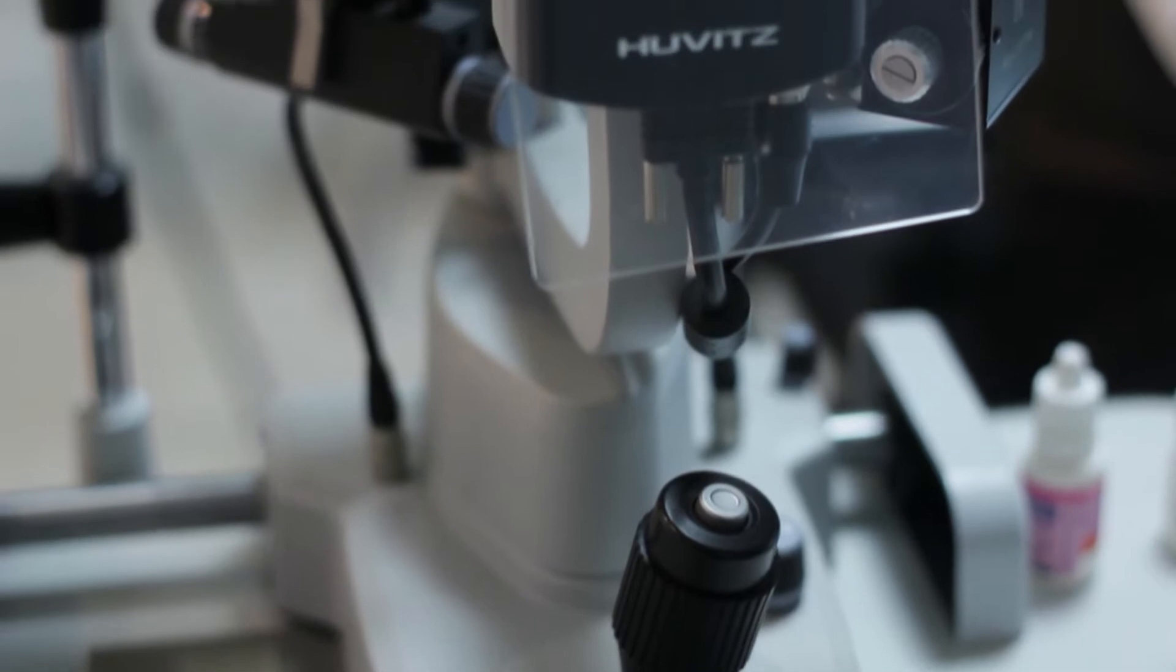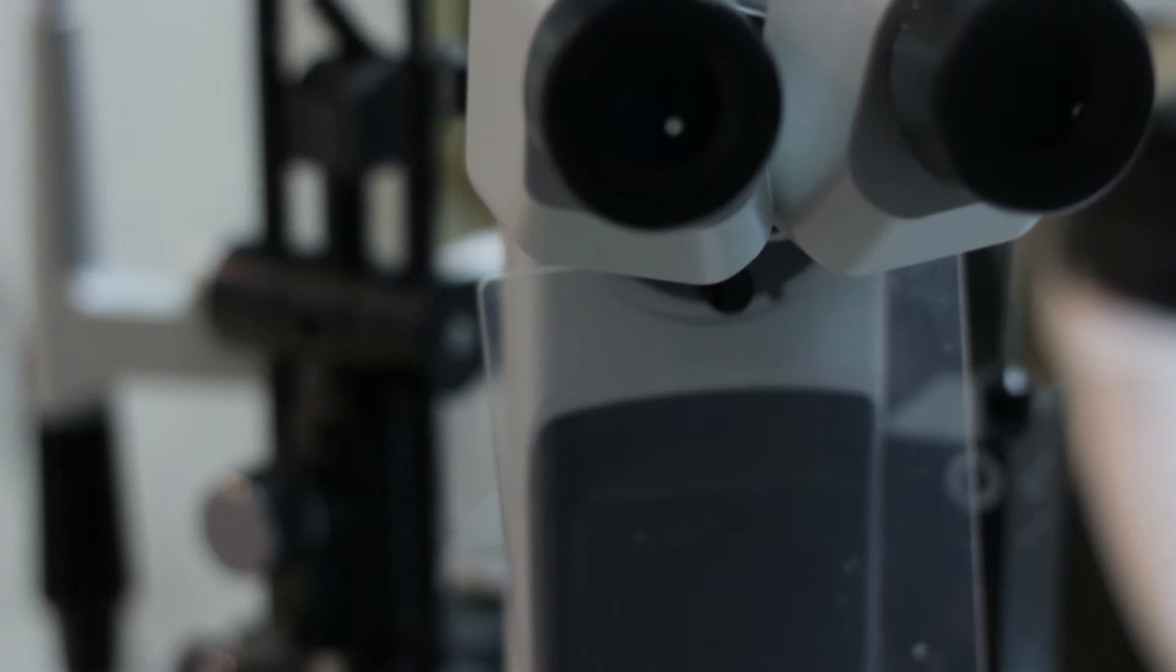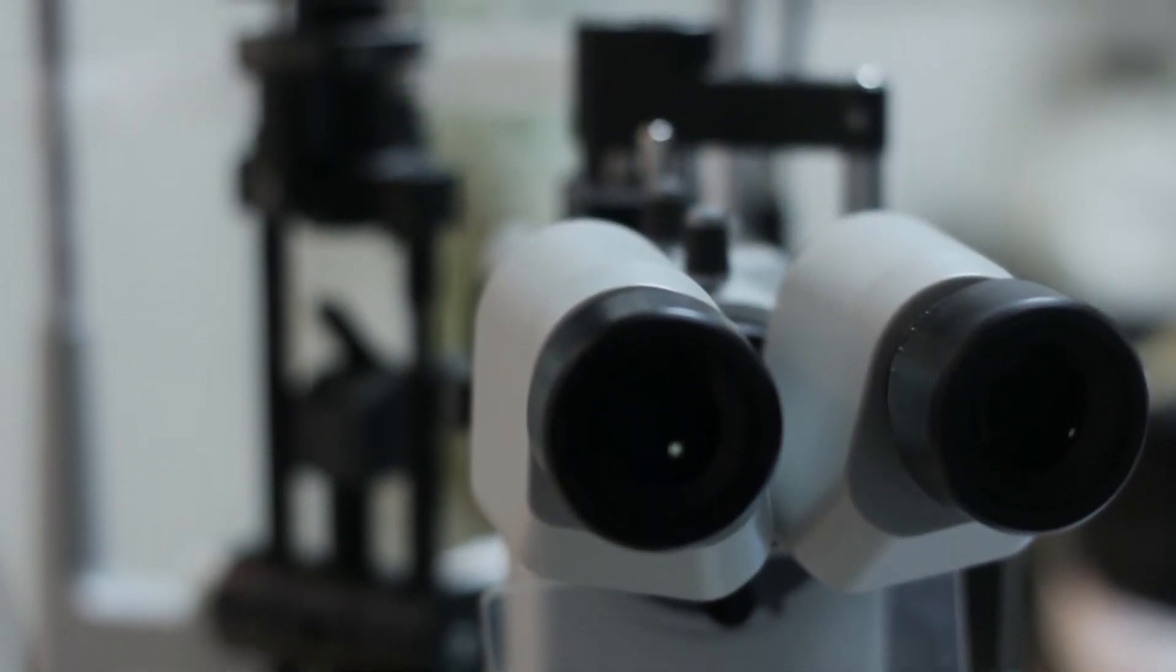This equipment gives very good and excellent results which are also very accurate, and provides a very high quality of vision to the patient. The recovery time is very fast. About one hour after the surgery, the patient can leave the clinic and even drive home. We try to treat patients in the best way, to give them the best service and the most personal service you can get.